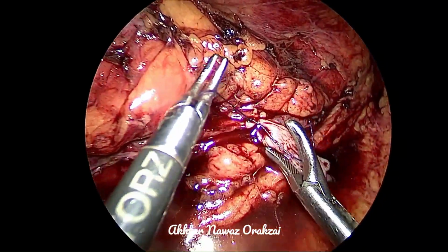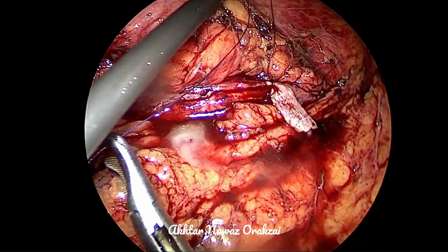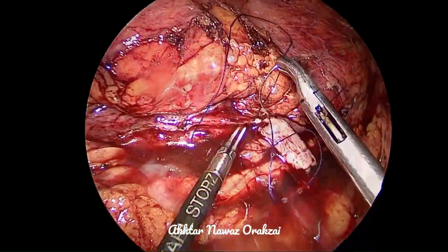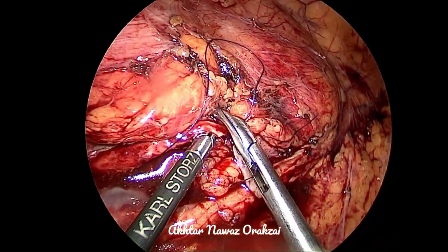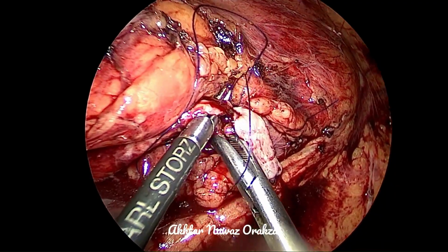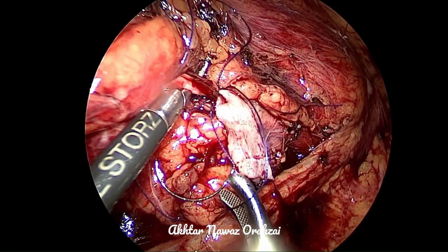So after securing the first knot, what we are going to do is pass the needle behind our anastomosis and bring it to the other side so that we can repair and do the anastomosis from the inside.